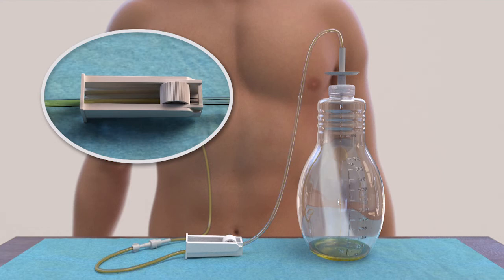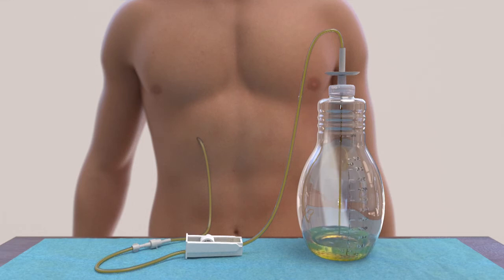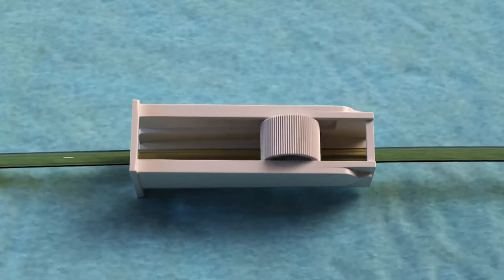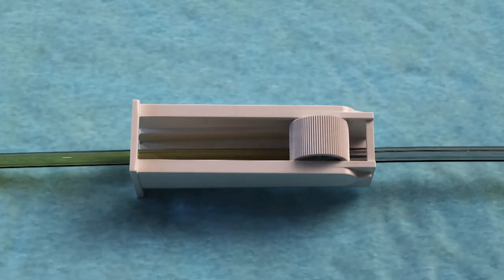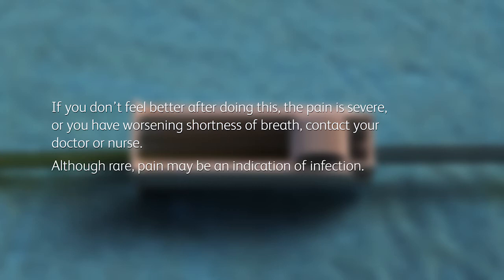Drainage usually only takes 5 to 15 minutes. It's normal to feel some discomfort or pain when draining fluid. If you do experience discomfort or pain when draining, roll the wheel on the roller clamp toward the bottle to slow or stop the flow of fluid for a few minutes. If you don't feel better after doing this, or the pain is severe, or you have worsening shortness of breath, contact your doctor or nurse.